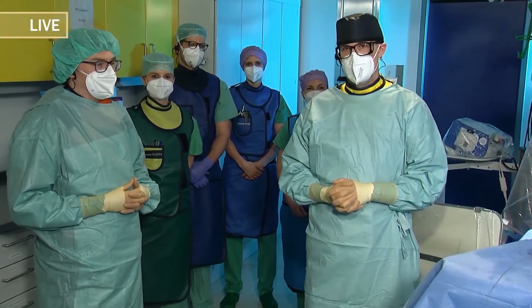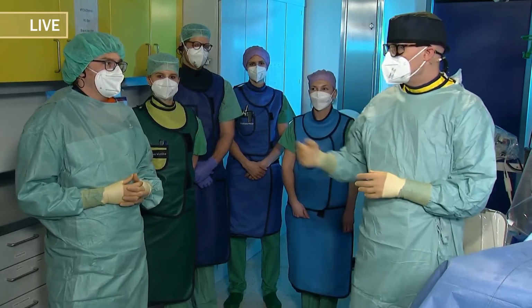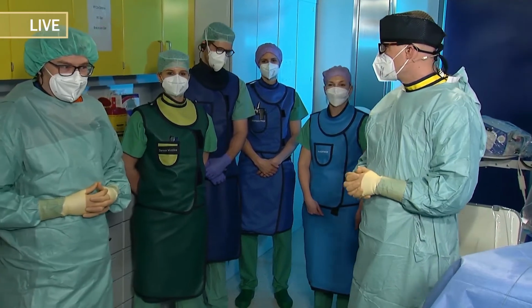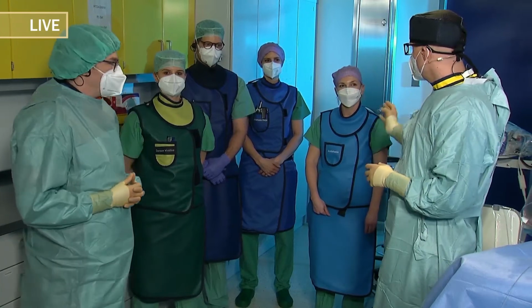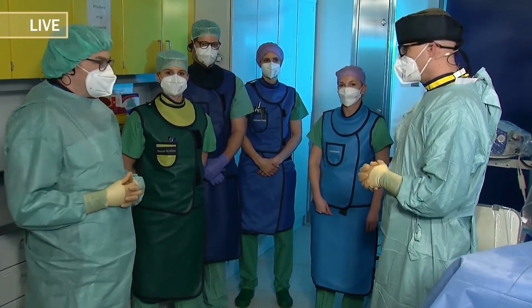First, I would like to introduce our team. My name is Philipp Raake. My second operator today is a senior physician from our department, Matthias Konstantin. We have technical support from Doreen Wood-Silka. Philipp Schlegel is our interventional echocardiographist, and we have anesthesiology with Ingrid Bangert and Anja Schüppmann.